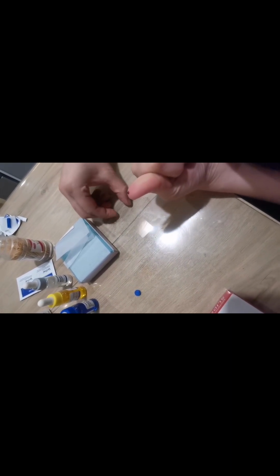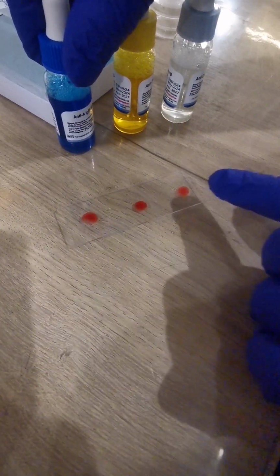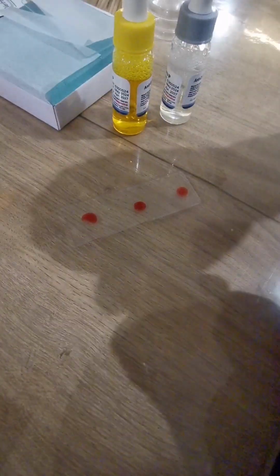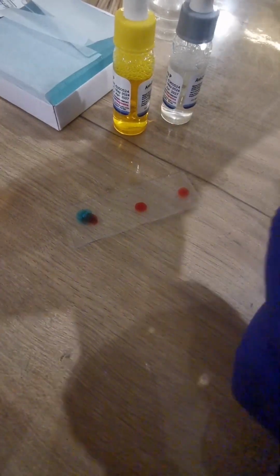Now I'll put this drop of blood on this slide. We need 3 drops of blood on the slide. Now I have my blood, I put 3 drops of blood. I will add anti-A antibody to the first drop of blood, but pay attention, do not touch the blood. Okay, this is the first one.